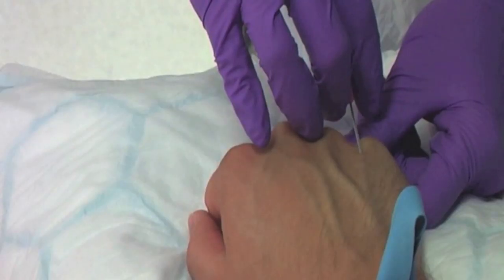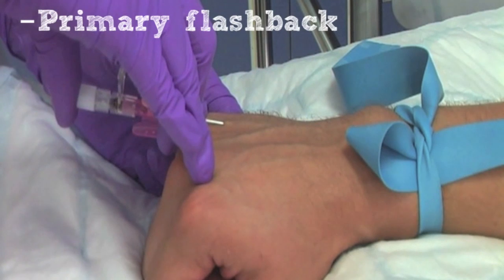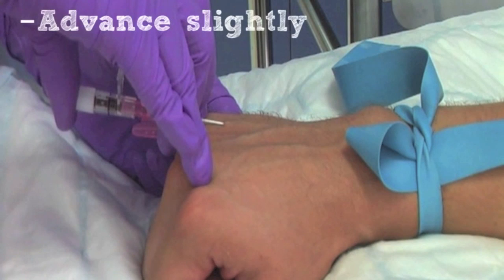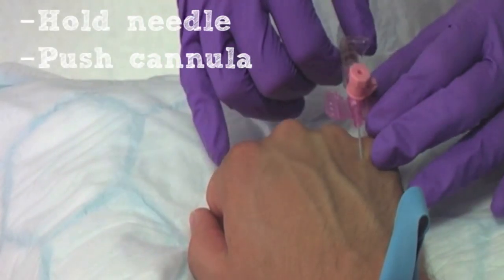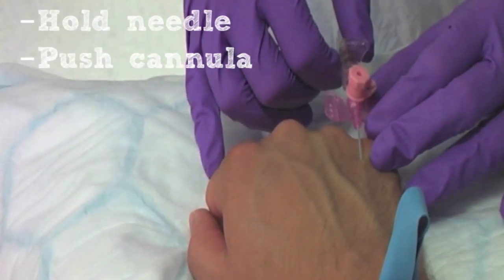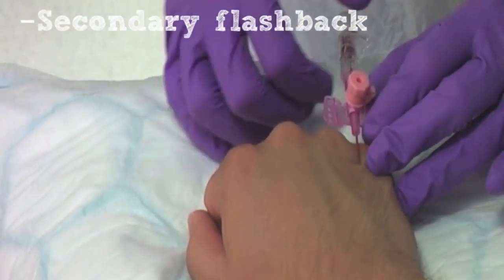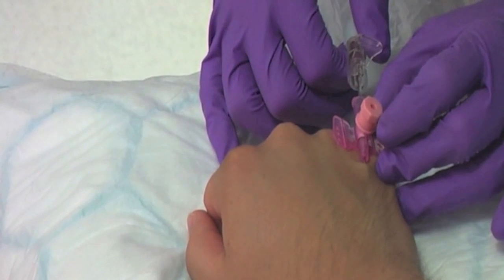You should observe a small amount of blood, the primary flashback, in the flashback chamber, as can be seen here. Advance the device a small amount to ensure the cannula is within the lumen of the vein. Securely hold the end of the needle and push the cannula forward off the needle into the vein. You should notice blood moving up the cannula. This is known as secondary flashback and indicates that you can now release the tourniquet. Hold the needle still and advance the cannula fully into the vein.